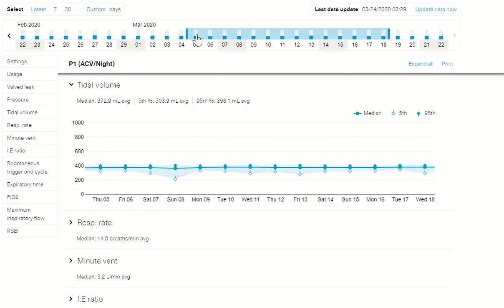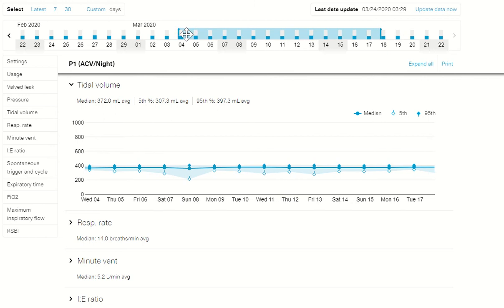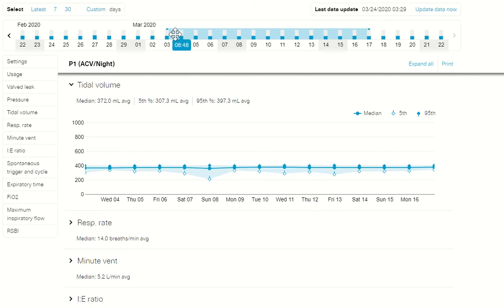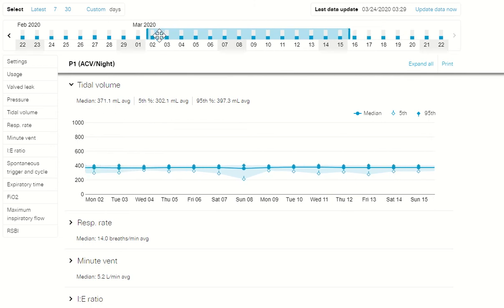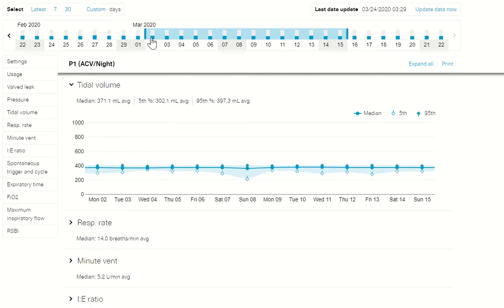When the timeframe is narrowed, graphs update automatically to show a more detailed view.